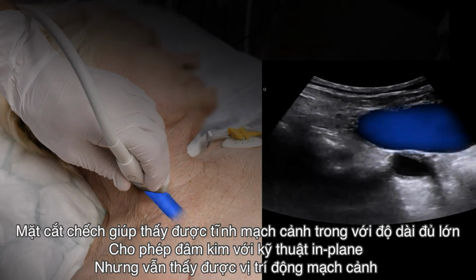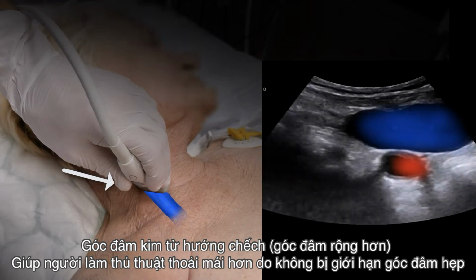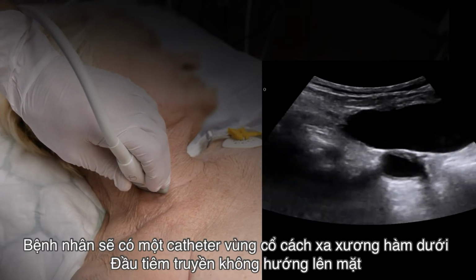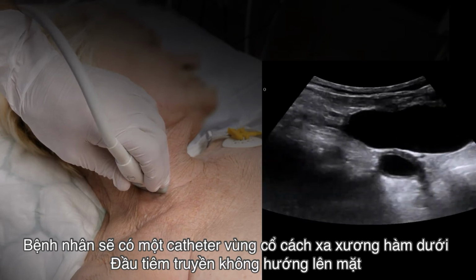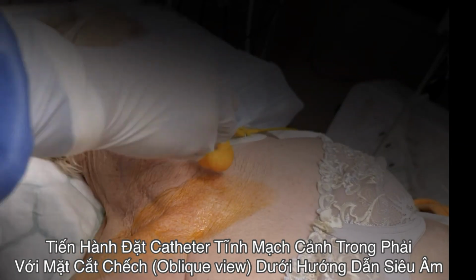If we superimpose the IJV, you can see how we slice it at an angle. This allows for an in-plane approach to the vein while still maintaining a view of the artery, thereby minimizing the risk of accidental arterial puncture. The angle of the cannulation also allows for greater comfort for the physician, who can stand at the side of the patient during the procedure, but more importantly for the patient, who gets a central line further away from the face.